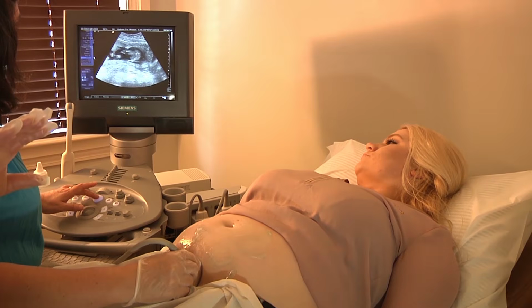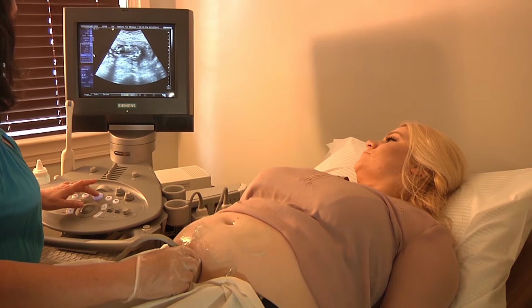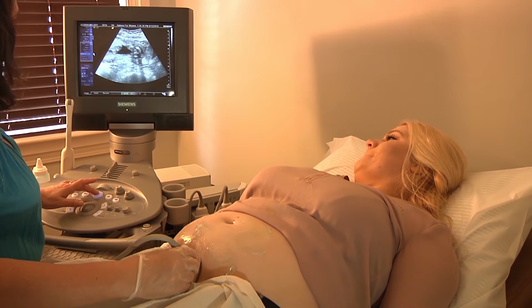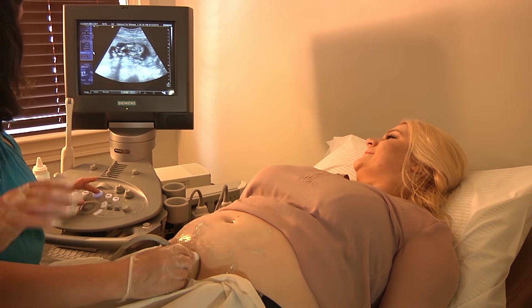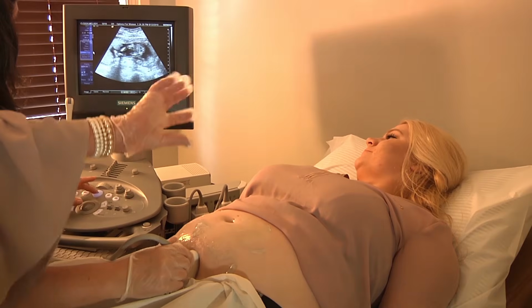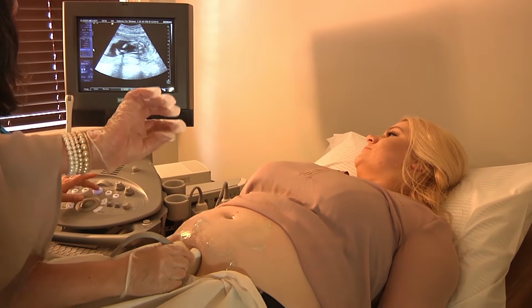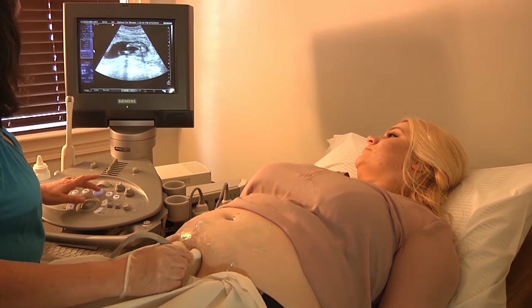Almost. Almost. Move out of the way. I'm not moving, he is. I know. I mean, I don't know if it's a boy, I'm just saying that. Just turn it a little bit this way. Keep in a little bit of movement. Okay, you're getting it.